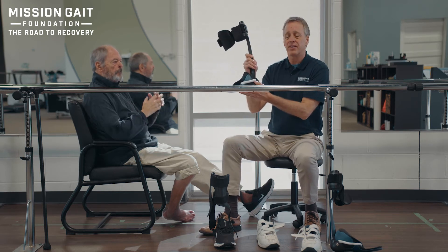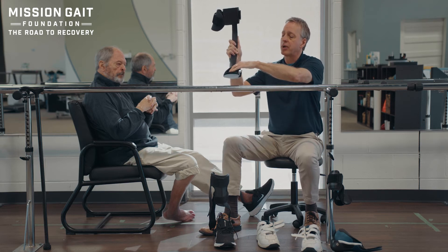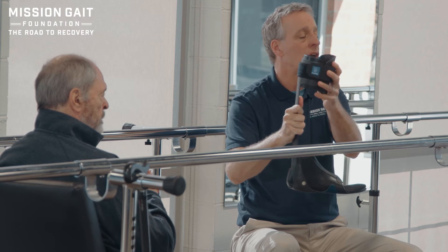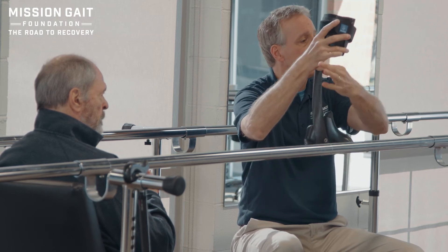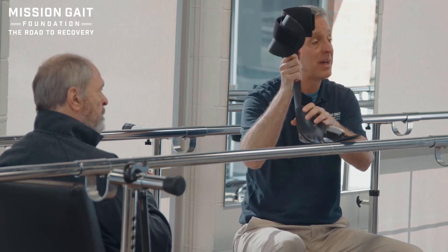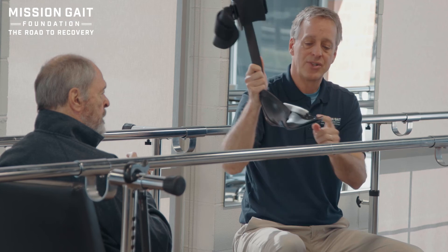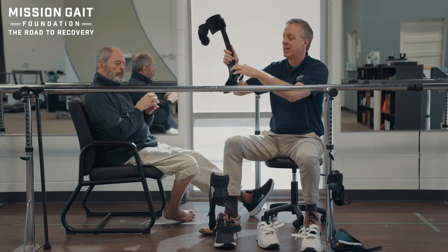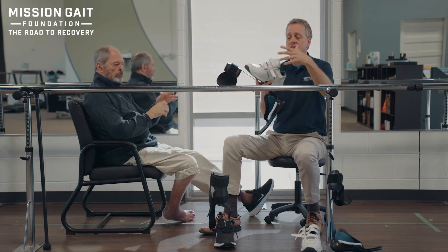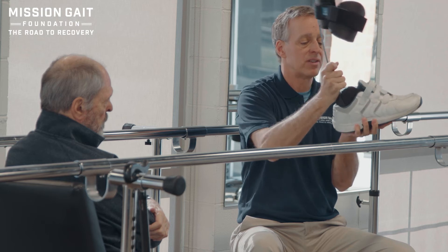This one has a boot built right into it, trying to create stability on the lateral aspect and cupping all the way around the foot, so it no longer needs an insert inside because the boot becomes the insert. The brace comes all the way up and locks the plate closed in the front, transferring all that energy into the upright for a good energy return and lift component. The benefit and drawback is it's custom made - it wraps and fits very tight, but once it's on there are many places for it to rub. We've already added padding in several spots on this new brace to reduce pressure. A Velcro closure shoe allows a really good opening without dealing with laces, and you remove the insert from the shoe because the boot becomes the insert.